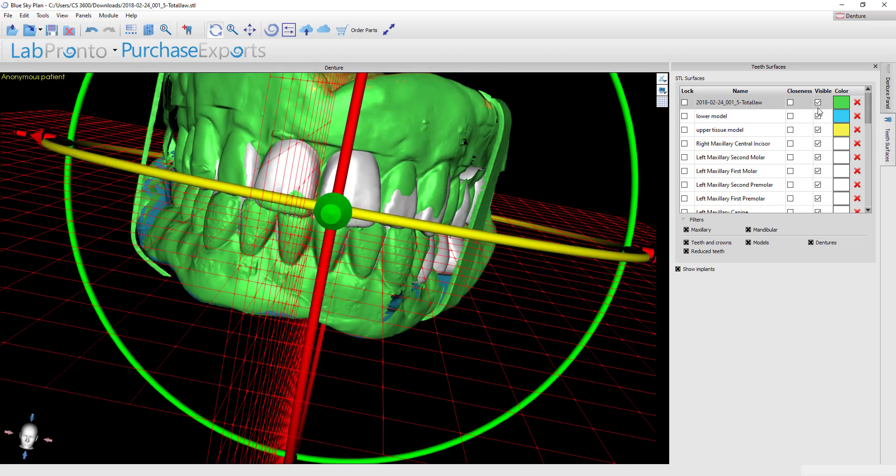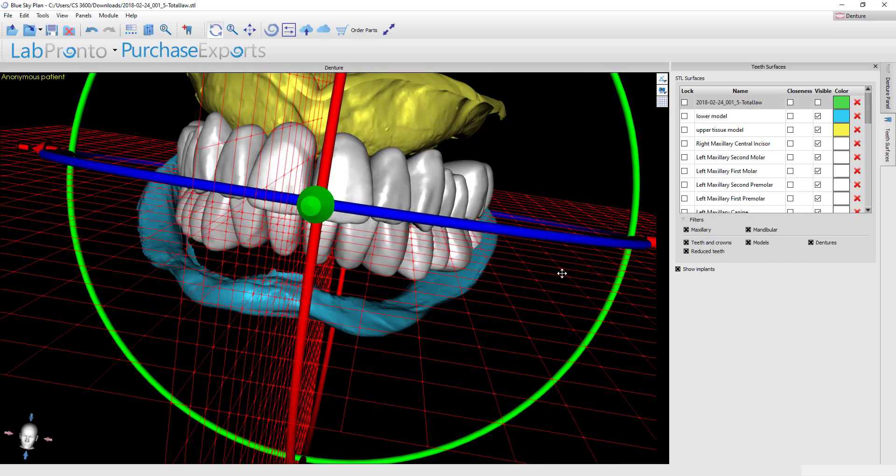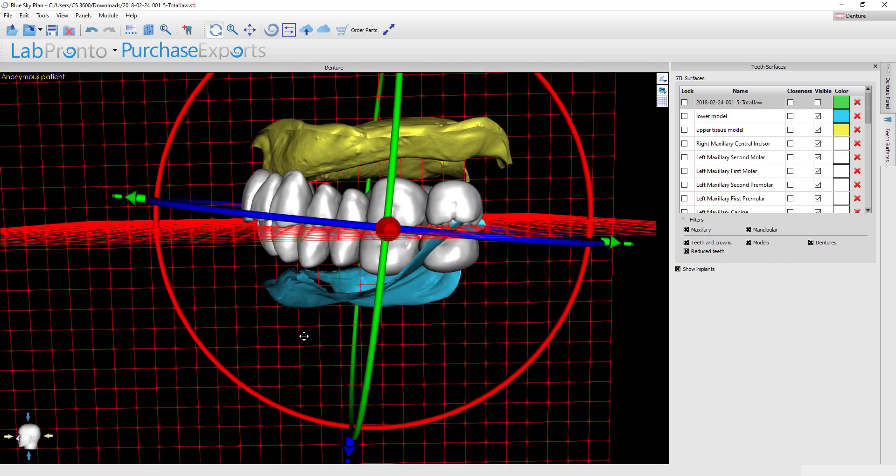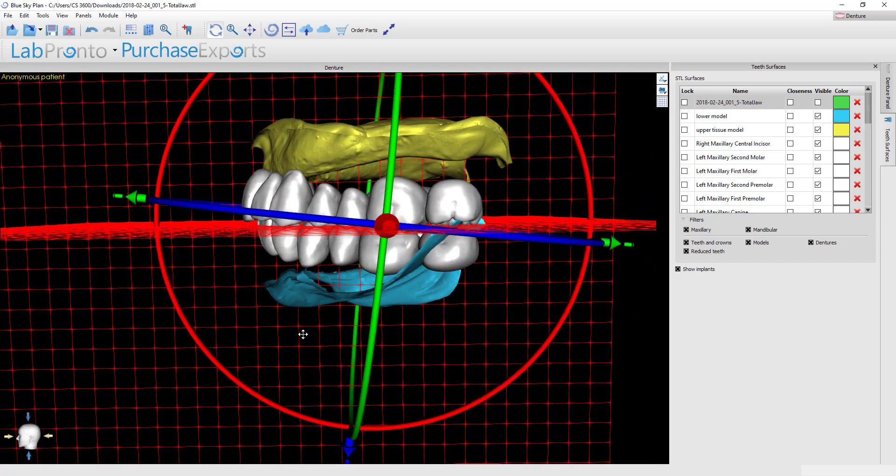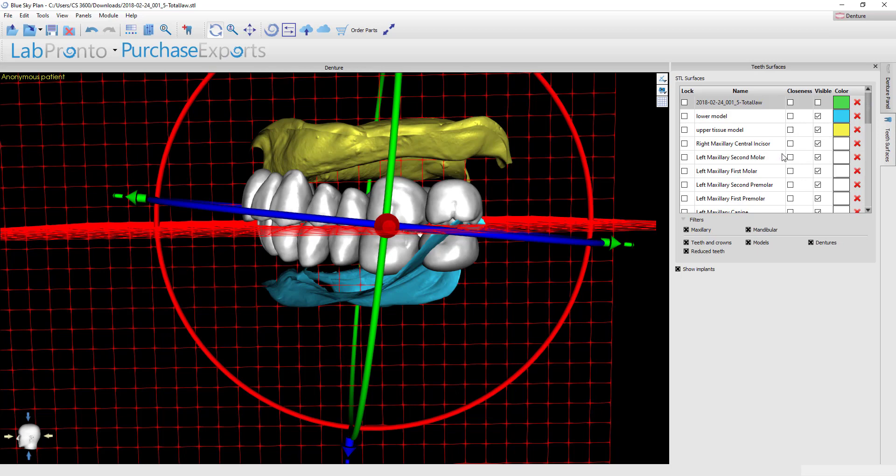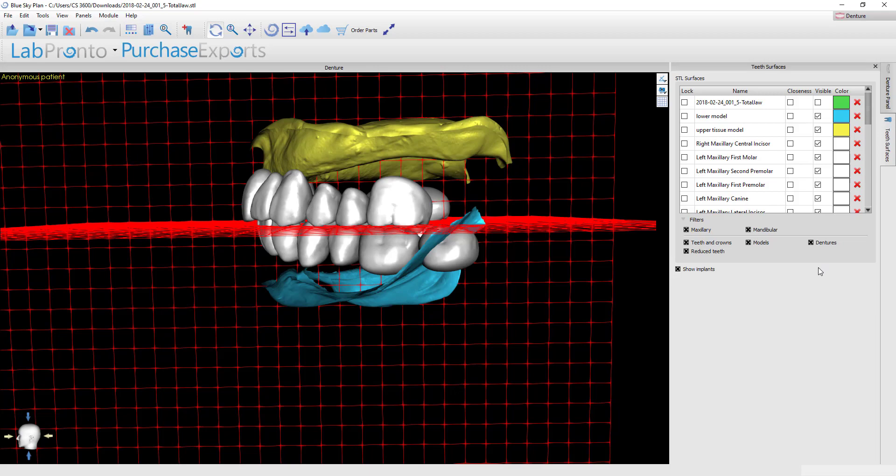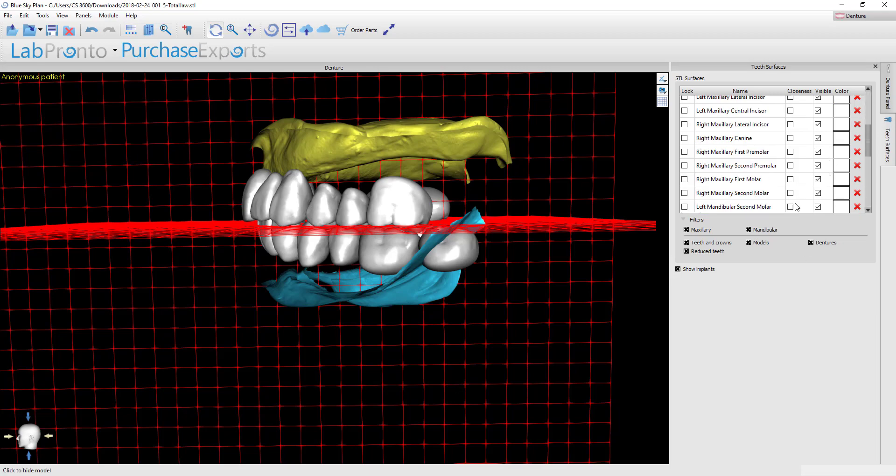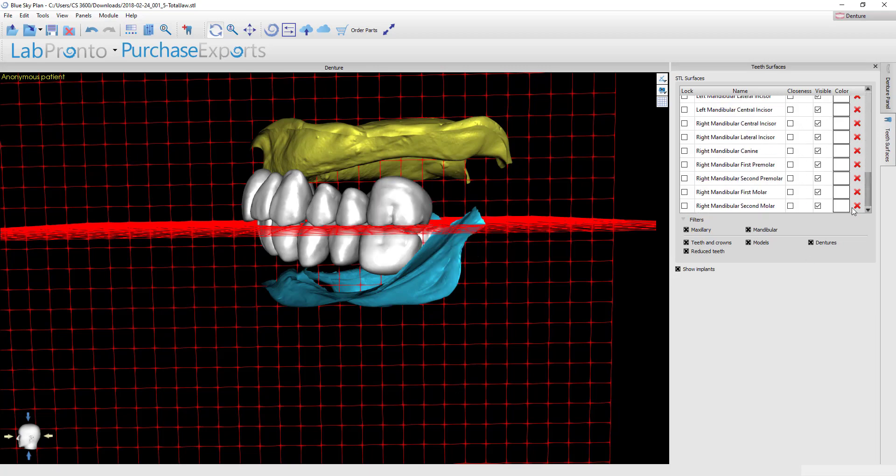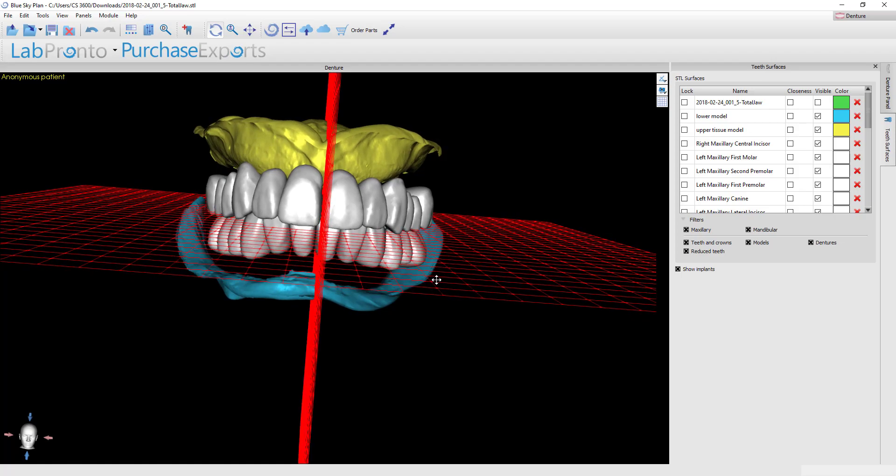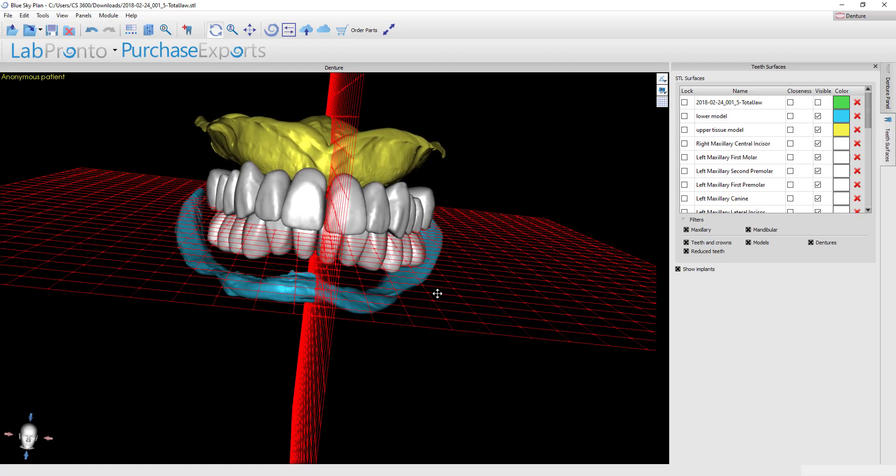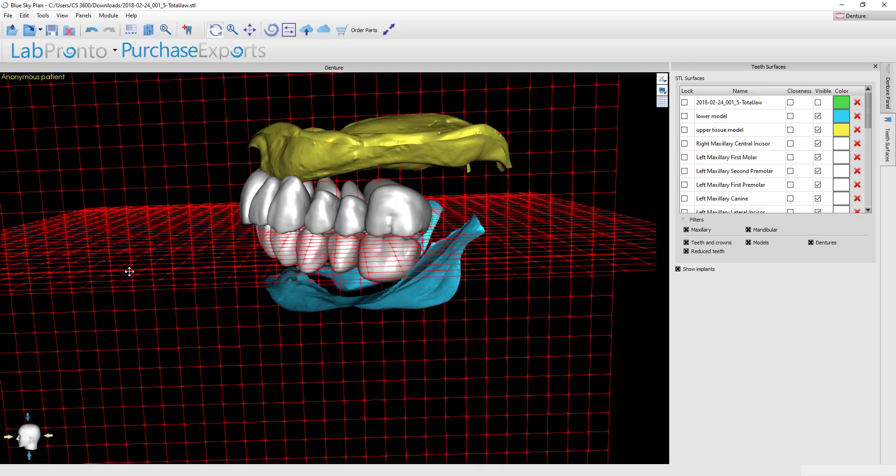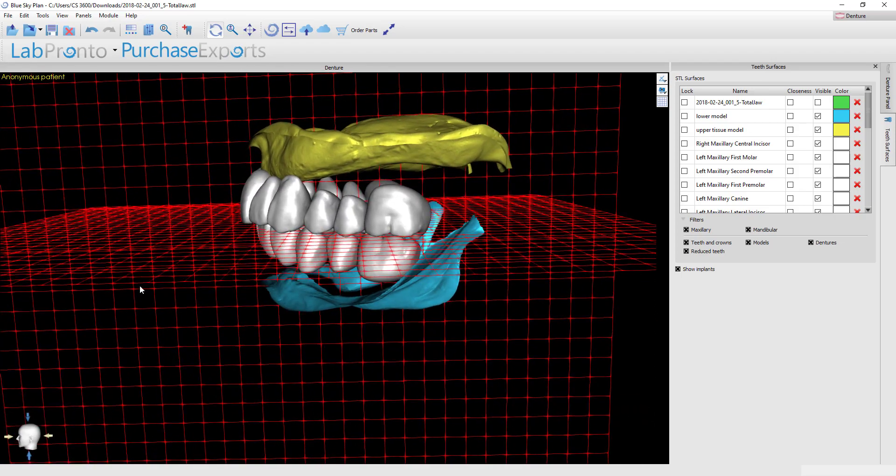Rather what I think I would rather do is to just delete the second molars and we could just go with first molar occlusion. That's a very common occurrence in dentures and I think that would work out very well. If you look over here in your tooth surfaces panel you can go and find the four second molars and then just hit the red X beside them and this will delete those. So I'm going to do that for all of the second molars.